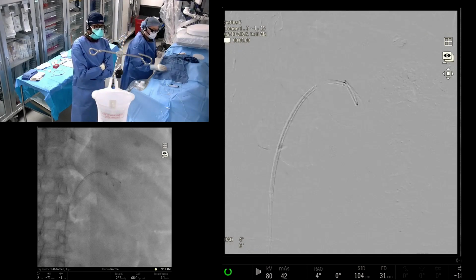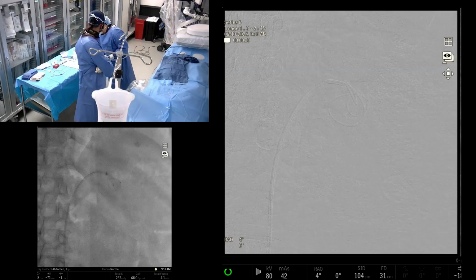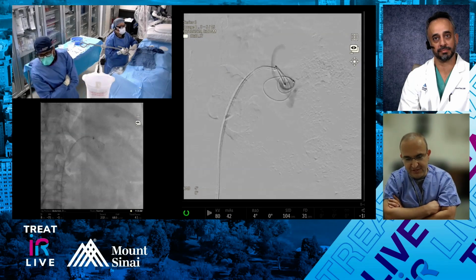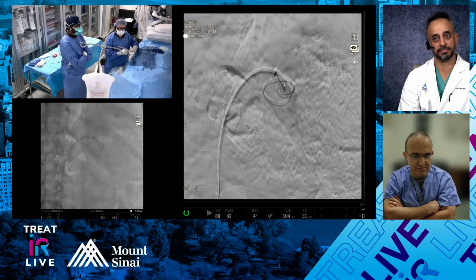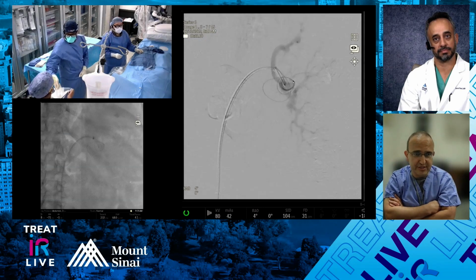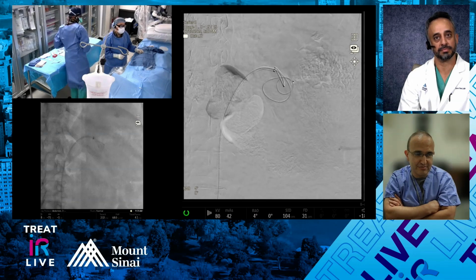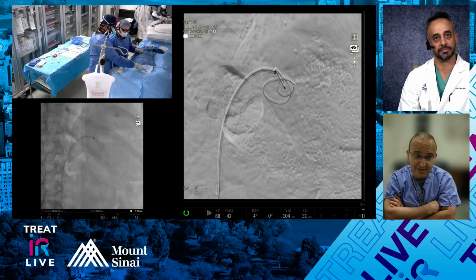So what are your thoughts in terms of embolization techniques? Emil, how would you approach this? Well, fortunately or unfortunately, depending on your viewpoint, we have a ton of different coils now. It comes down to what you're happy with and comfortable with. This looks really tortuous, so you need a softer coil. I don't fault anybody for using whatever coil they're happy with and what they have available. But I like the fact that you picked the longest one possible, just to reduce the time, as we say.